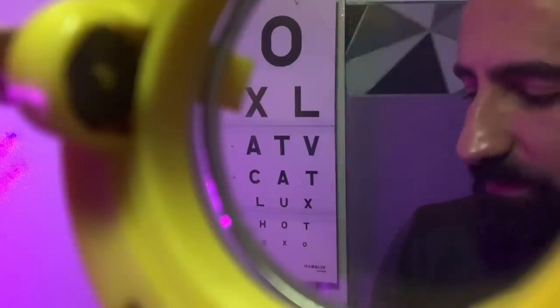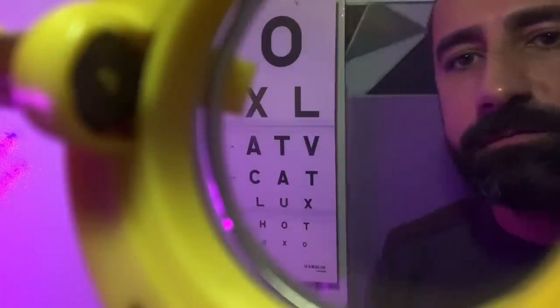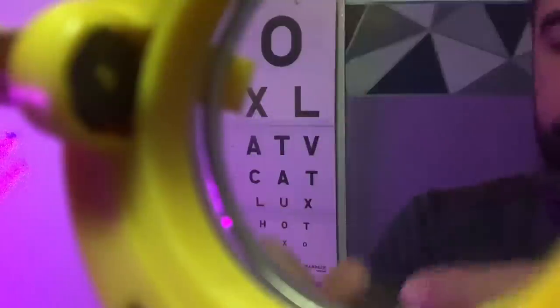Let's just see what the plus 1 diopter sphere does for you. So again, focusing on the print here. Is it clearer with the lens or without? With. Without. Fantastic. I'll leave that one out. And we'll try one more lens. Plus 0.25. There might not be much difference here. Just want to confirm. Is that print clearer with or without the lens? With or without? Excellent. Okay.